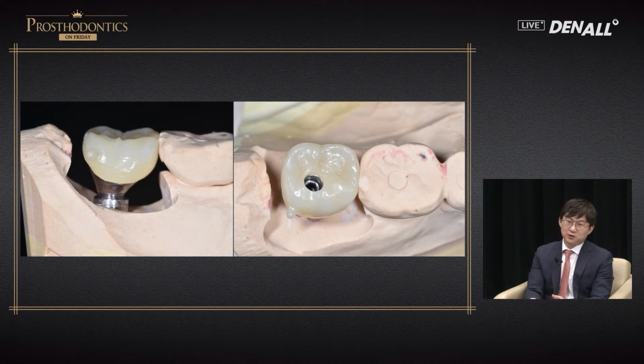Implant level screw type can be used clinically. That's what I thought. So when we even make a profile, we don't use the custom abutment. After the cementation, screw type is used, then custom abutment is not necessary. So that's my recent approach that I employ.